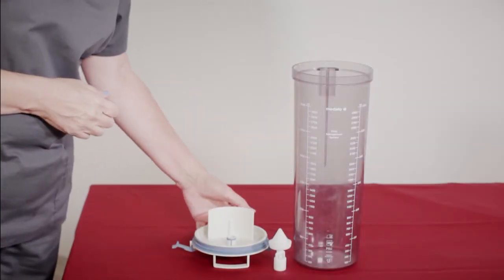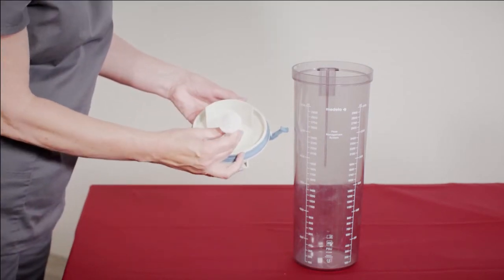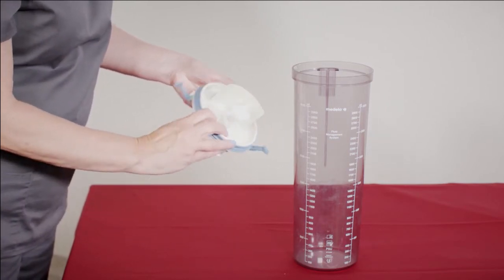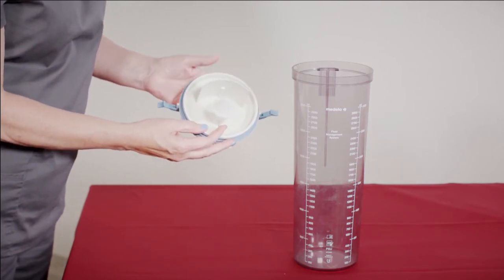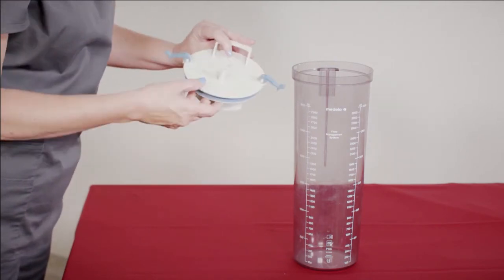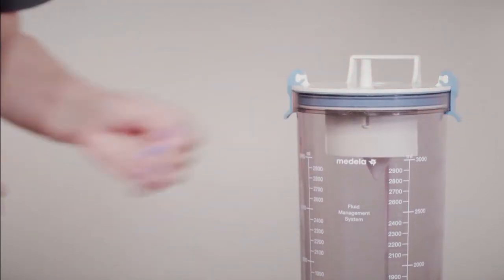All parts must be present for the Medela non-disposable secretion container. Connect the float valve to the bottom of the lid. Ensure locking clips are present. Assemble with measuring scale to the front. Attach the lid with the handle towards the back of the secretion container and secure into place using the locking clips.